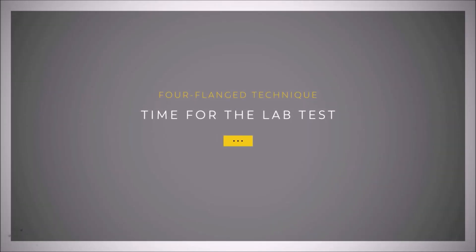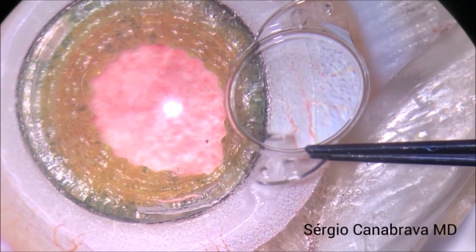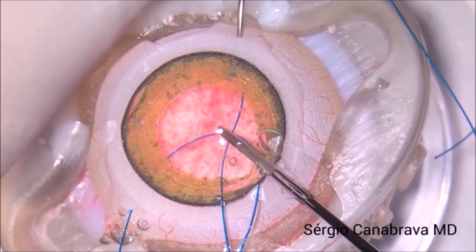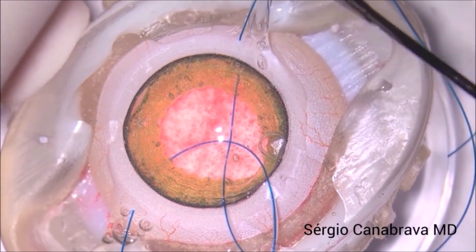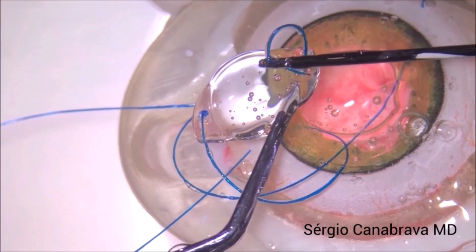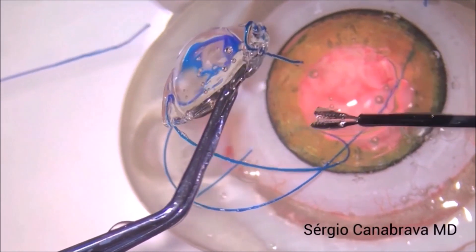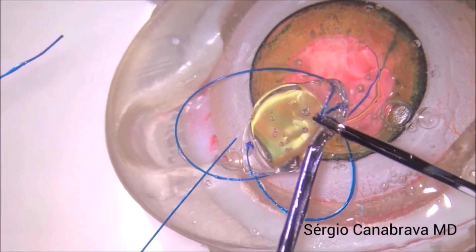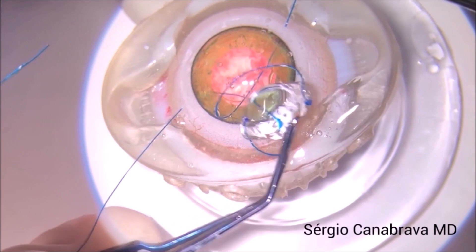Time for the lab test. In our lab test, you can observe that we pass the 5.0 proline suture through the eyelet, first up, down, and make the first flange. You can see on both sides how you can easily adjust the proline suture in the haptic.